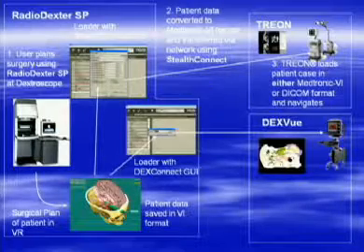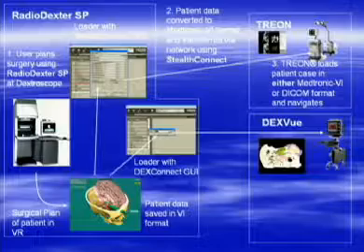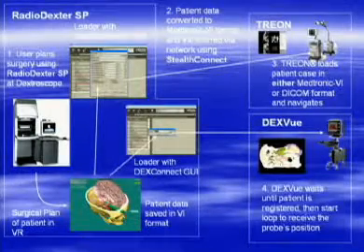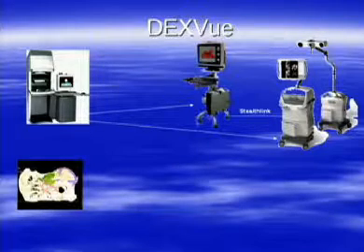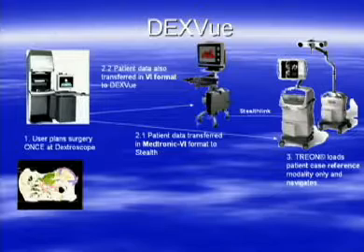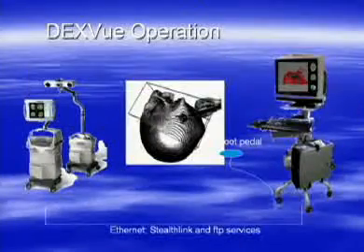So at this point, the topology is such that we actually have two independent devices with the same data sets working with each other, and the location of information was being transmitted by the Trion to the DexView for display. This was created intraoperatively using the StealthLink application and the Trion basically powering the DexView in real time.